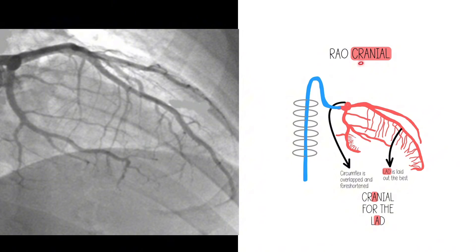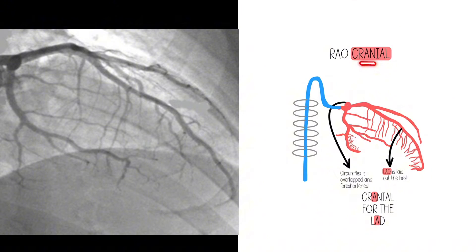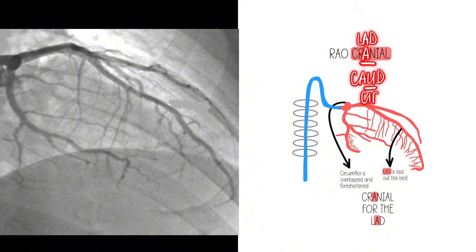Now how do we know it is cranial? Although this is really for the mid to distal LAD, we do see the LAD best in this view — it is the least overlapped. Cranial views are for the LAD, and caudal views are for the circumflex, because the circumflex has a 'U' in it — just to help you remember.